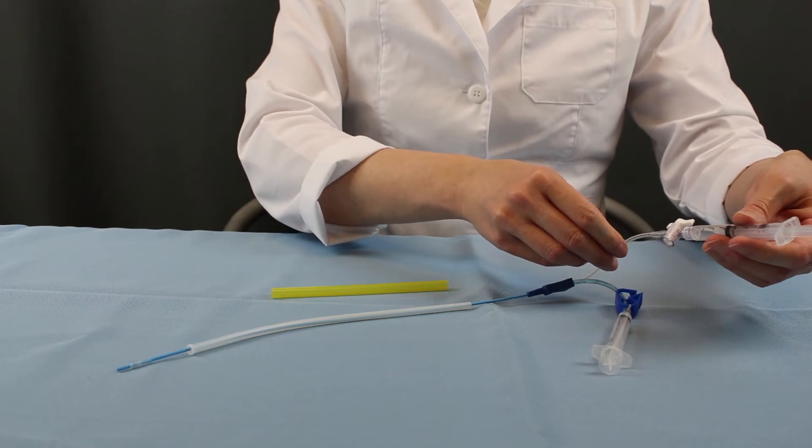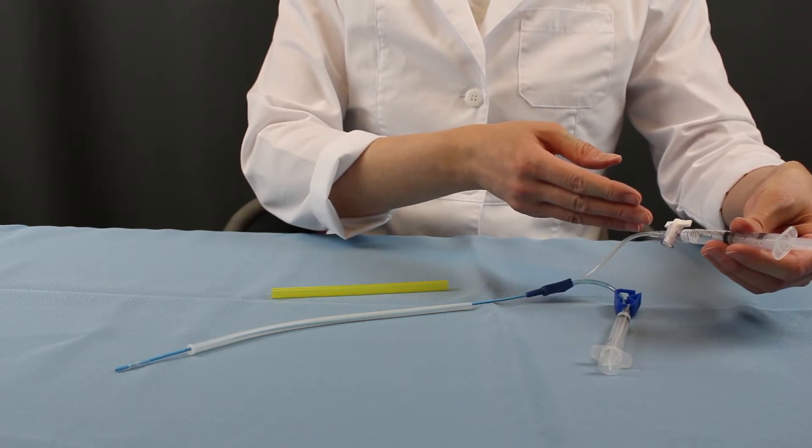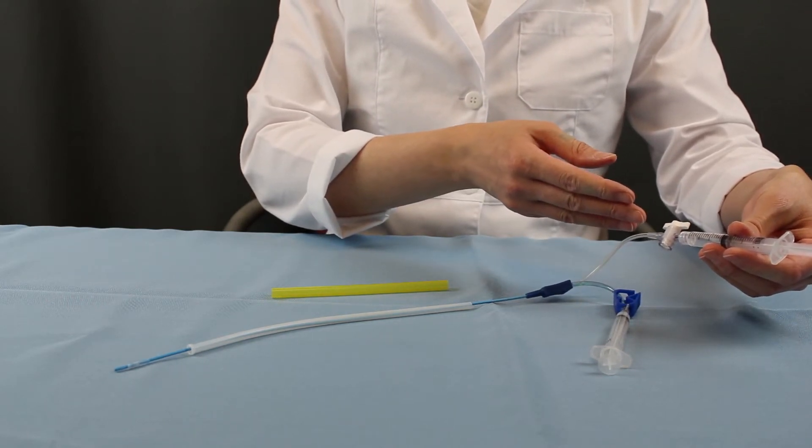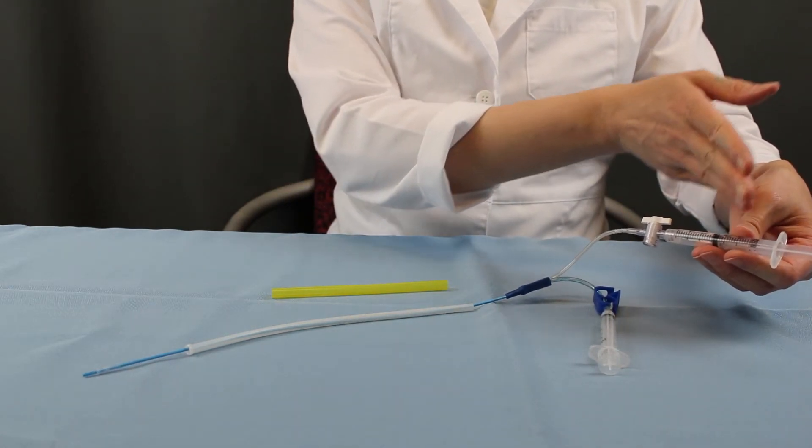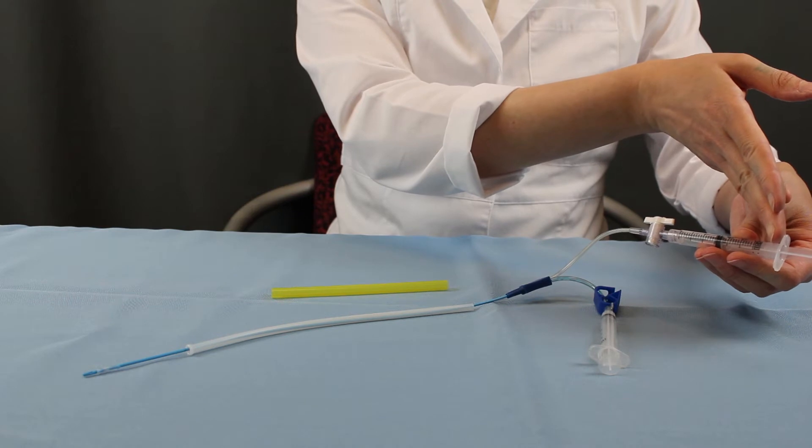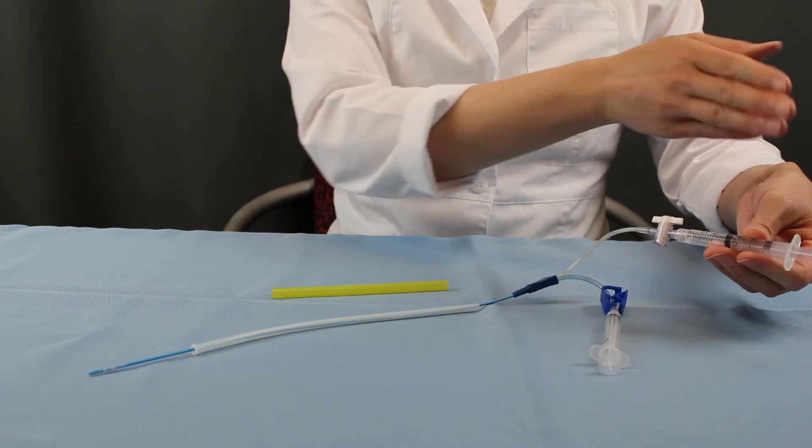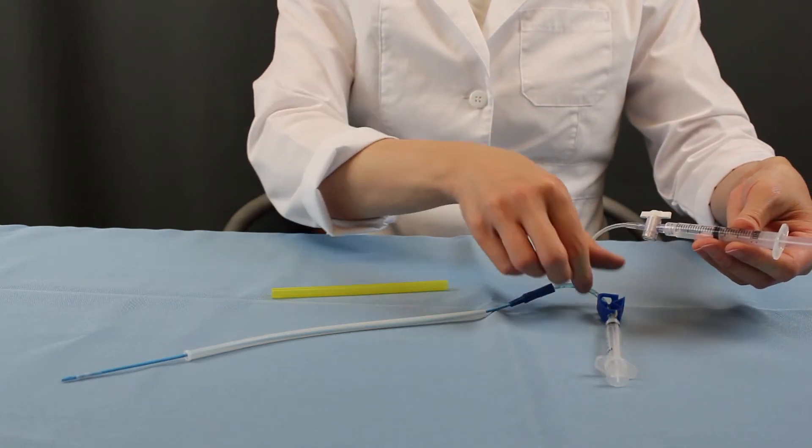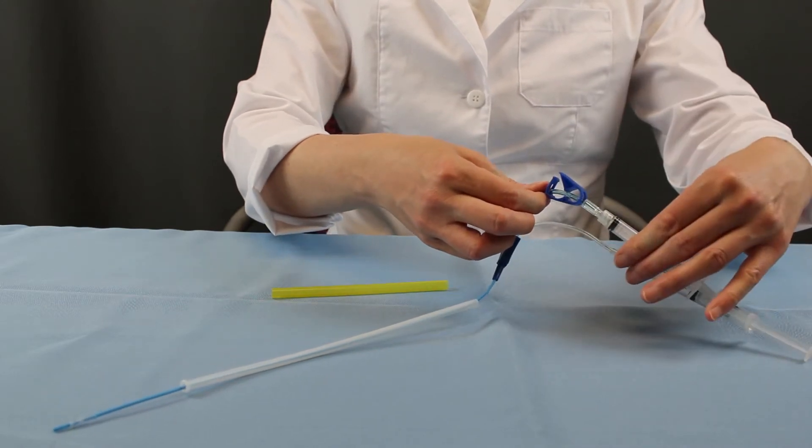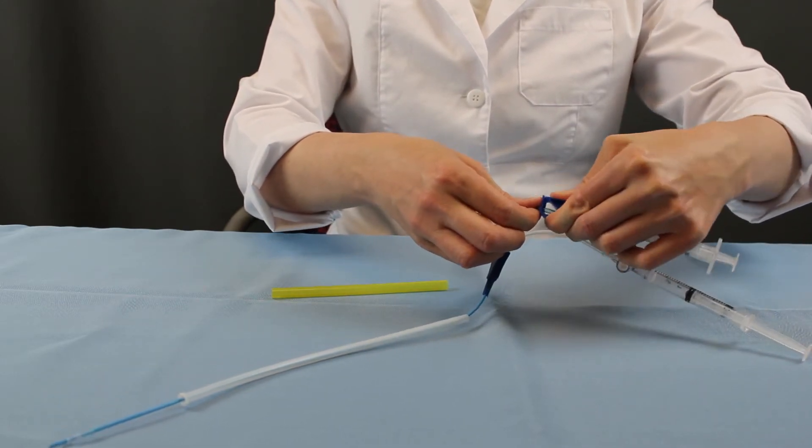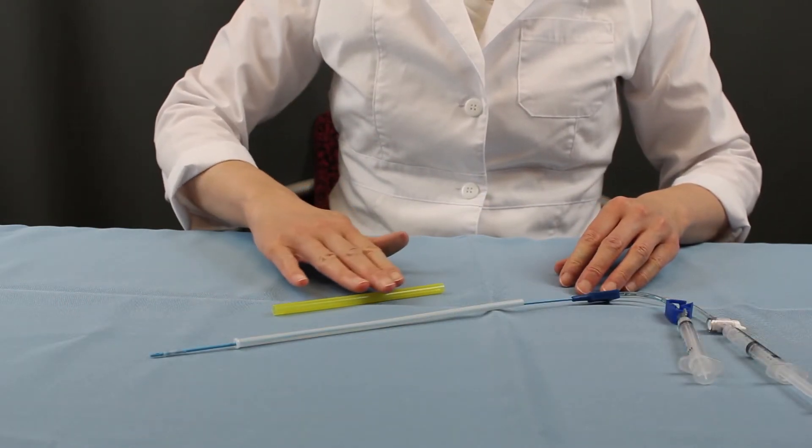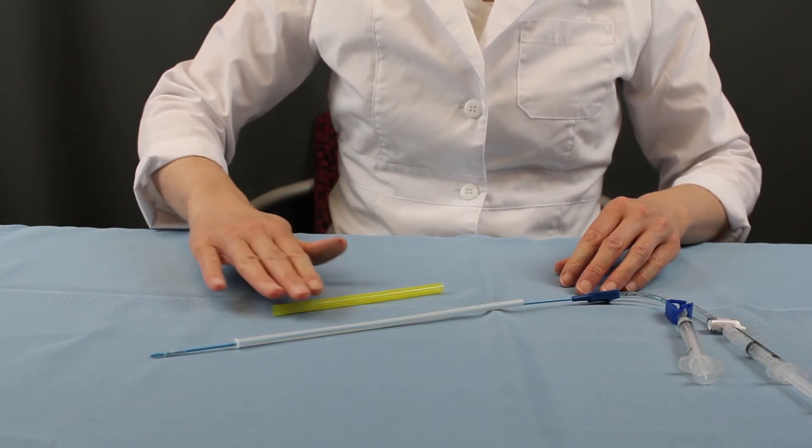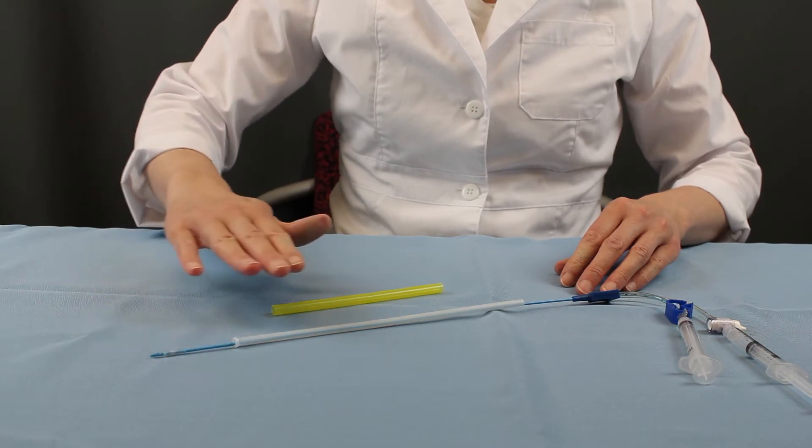The syringe attached to a stopcock is preset with the correct volume of air: 1.5 milliliters for the 5 French catheter or 3 milliliters for the 7 French catheter. The other components include a traditional pinch clamp oriented the same way as an IV. Every Thomas Medical catheter includes a yellow tip protector to safeguard the distal end during transportation.